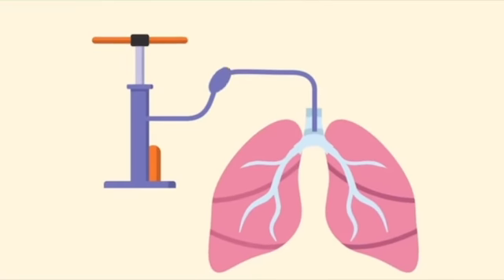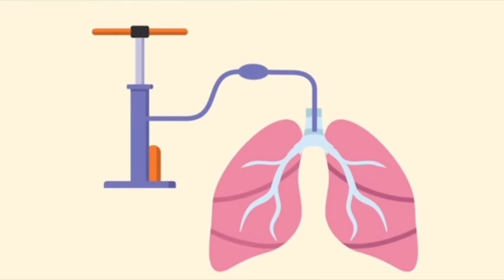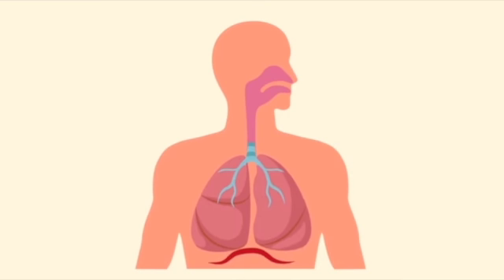Intubation and types of ventilators, starting on page 628. A mechanical ventilator is like an air pump. It pumps air into the lungs, but with a machine. It's a positive pressure ventilation, which is different than normal breathing.